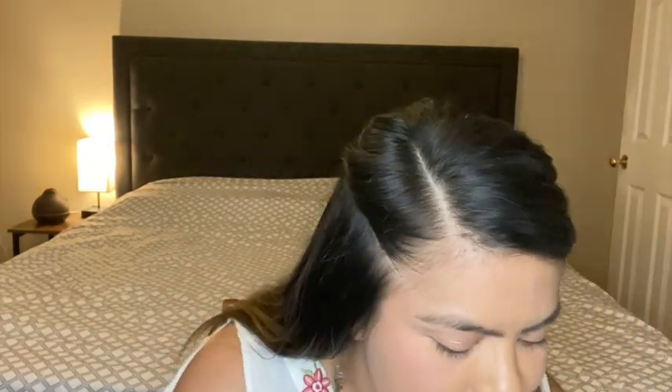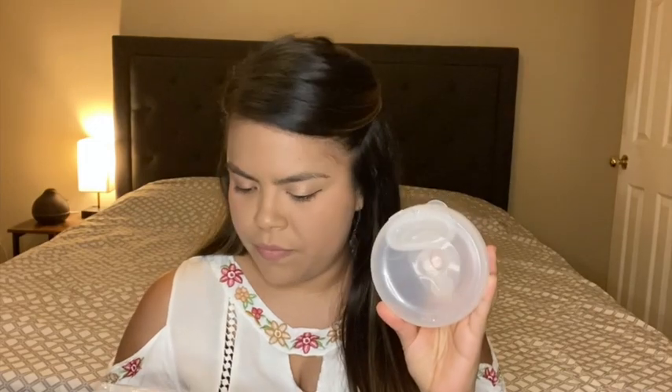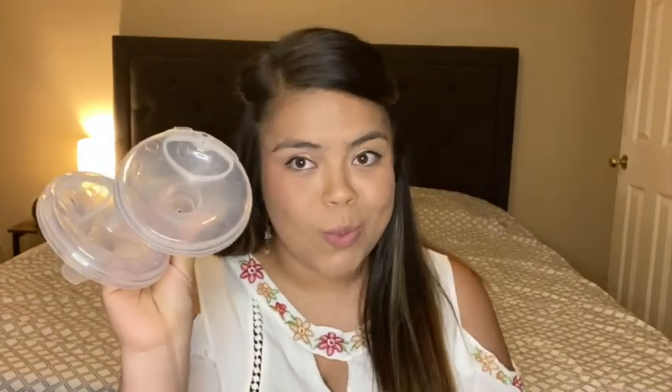I'll link their website below. They sometimes put it on sale for $149 or even $139, so definitely check it out. It comes with everything you need, including two flange sizes: a 25mm and a 28mm. I use the 25mm. They also sell other sizes and even an insert that makes the inside smaller if you need a smaller fit.